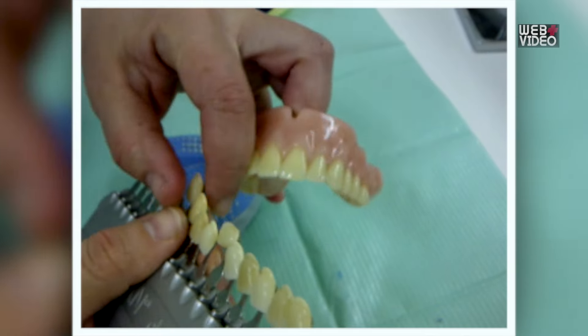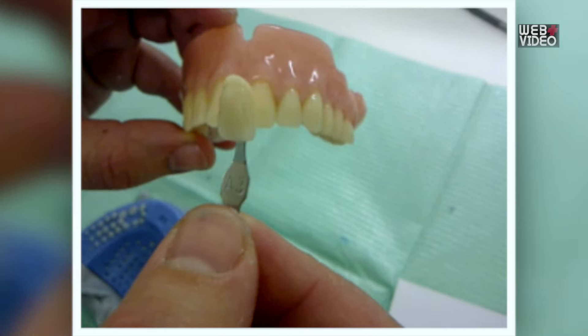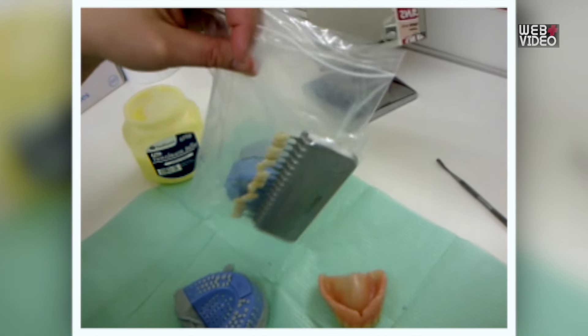Step 6: Select the colour of your teeth on the chart provided. Please ensure to return the chart as well.